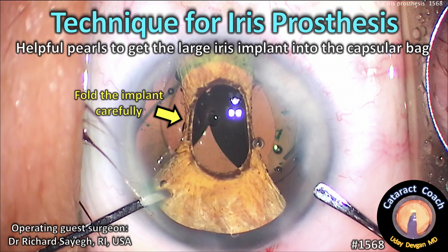CataractCoach.com technique for iris prosthesis. Helpful pearls to get this large iris implant into the capsular bag.